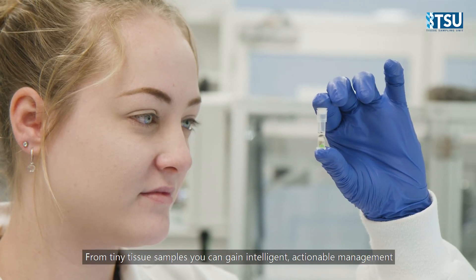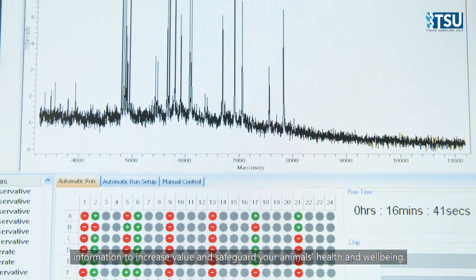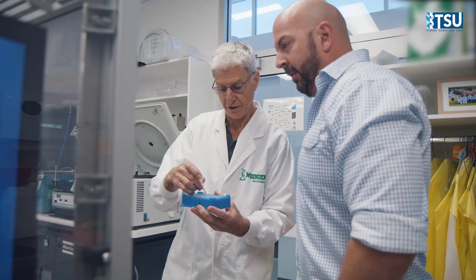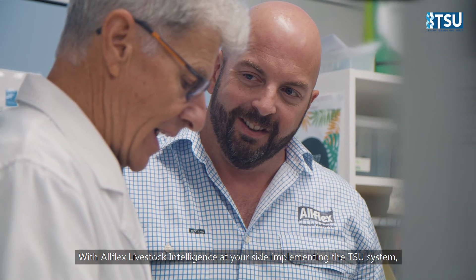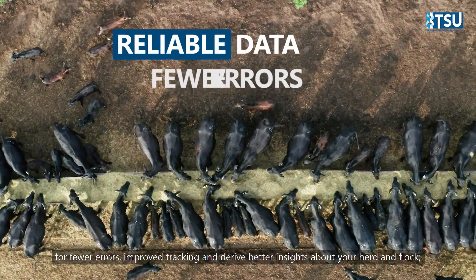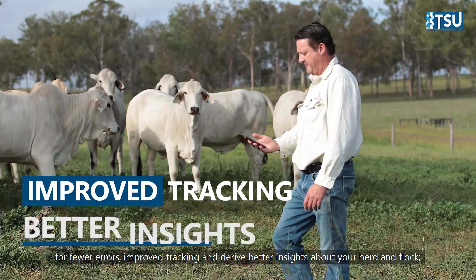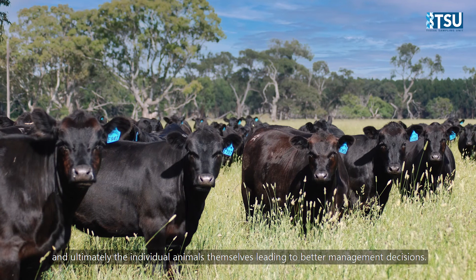From tiny tissue samples you can gain intelligent, actionable management information to increase value and safeguard your animal's health and wellbeing. With AllFlex Livestock Intelligence at your side, implementing the TSU system, electronic tags and visual tags, you can set a foundation of reliable data for fewer errors, improve tracking and derive better insights about your herd and flock, and ultimately the individual animals themselves.